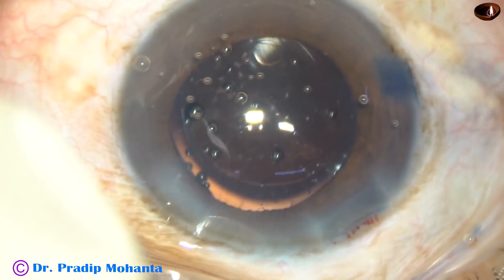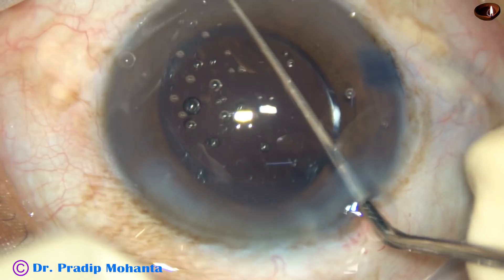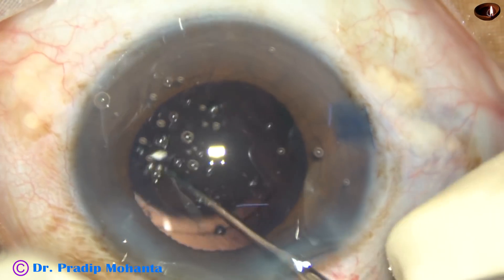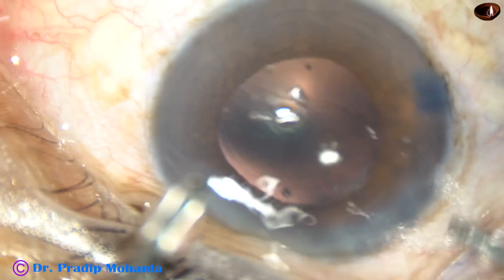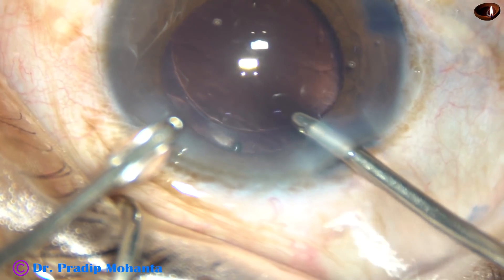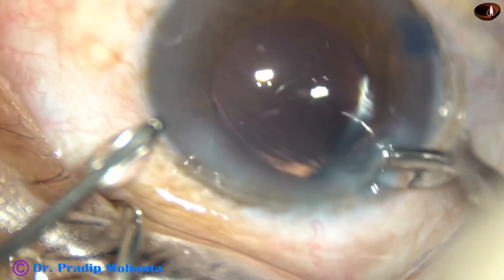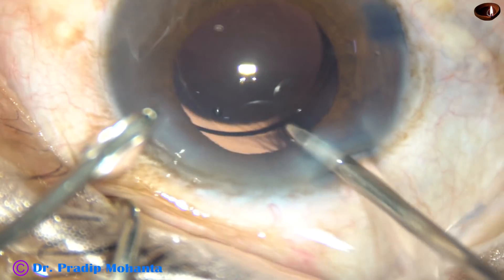This is a foldable intraocular lens. It has been placed in the bag. And now we have to remove the viscoelastic substance that has been used for implantation of the intraocular lens. Thoroughly irrigate the anterior chamber, then push the lens, go behind the lens.